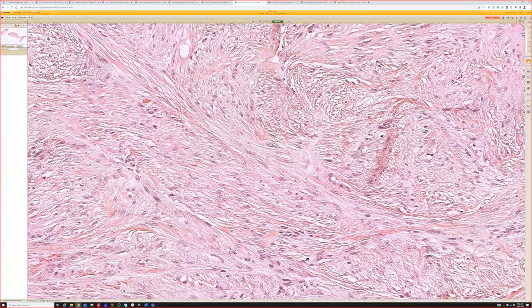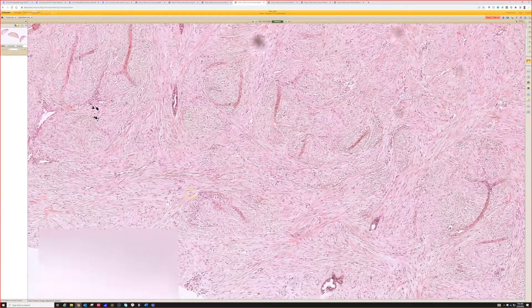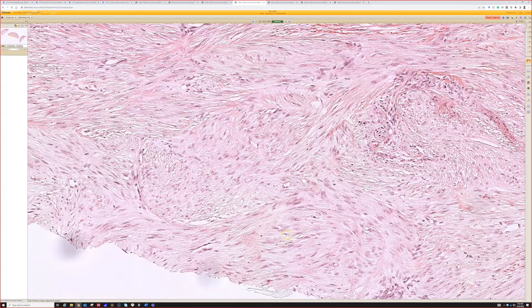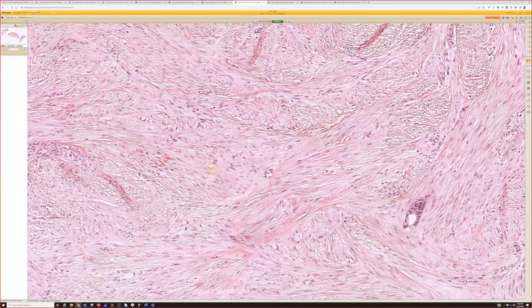This entity goes by two different names: infantile digital fibroma and inclusion body fibromatosis. As the first name suggests, they occur in babies on the digits. They are benign but can recur, and this is a really nice example of one.